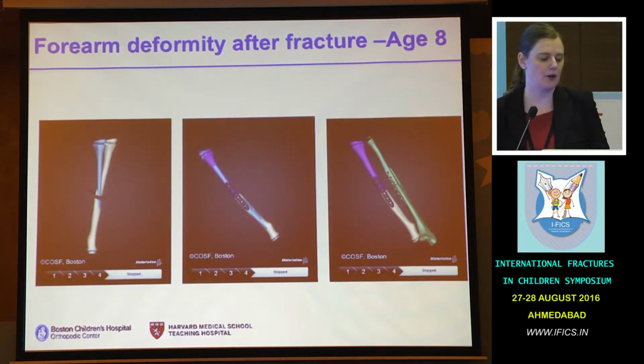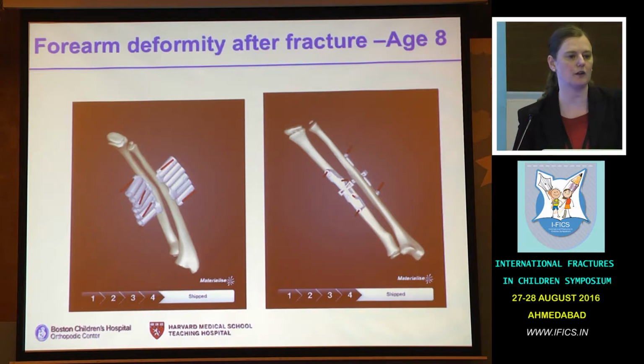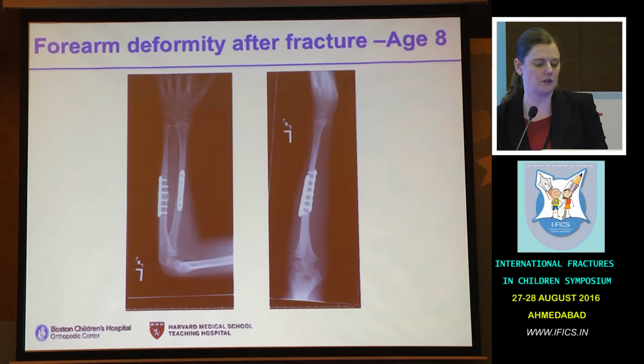The computer then goes about and creates the osteotomies with the assistance of an engineer. Then we put the plates onto the bones, and then we reverse engineer back to the deformity to then create drill guides and then saw guides in order to use them intraoperatively to correct. And you drill before you saw in this particular instance. And as you can see, we managed to create a very nice anatomic reconstruction with this technology.